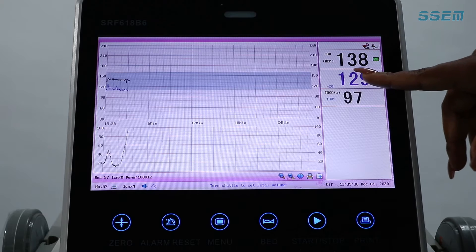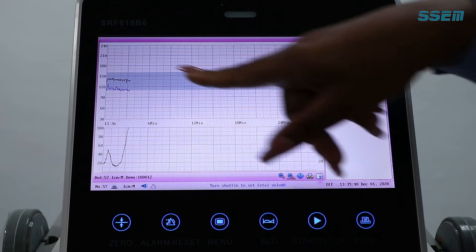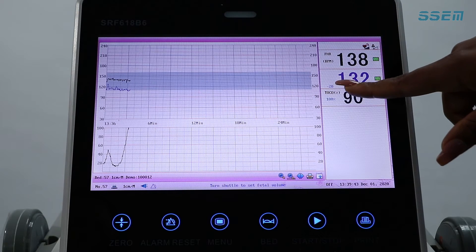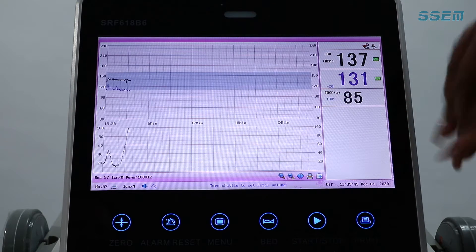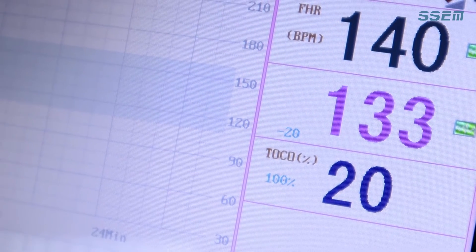FHR 2 has a negative 20. This ensures tracing separation. This is to ensure that there is no overlapping of the tracings. Remember when reading your tracing to add 20 BPM.